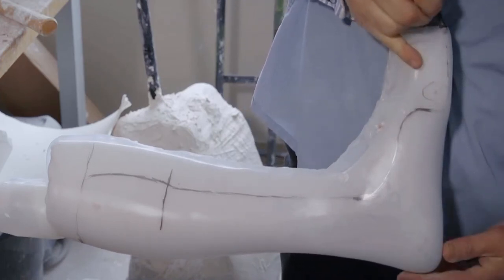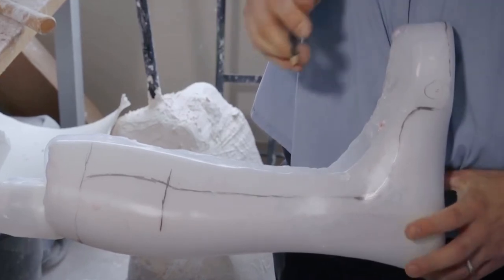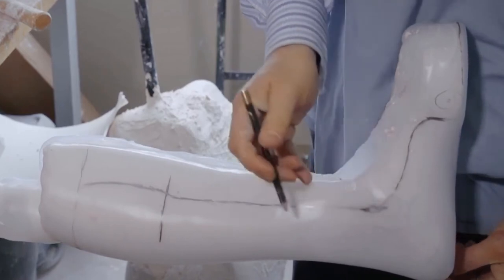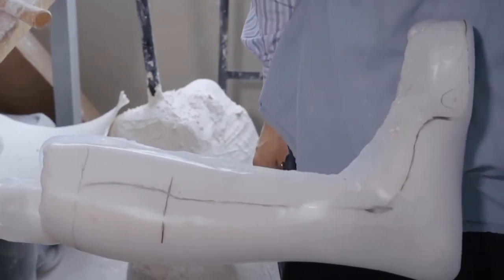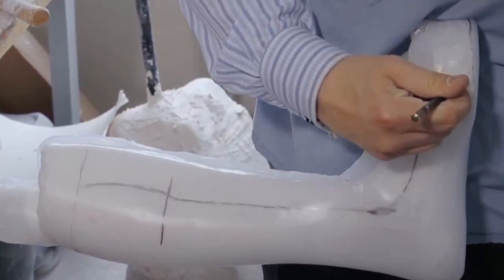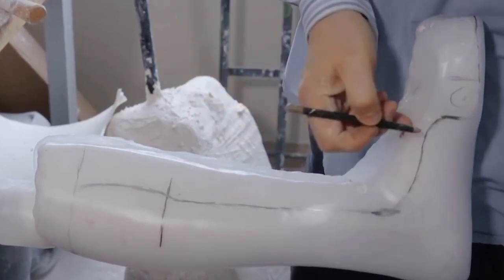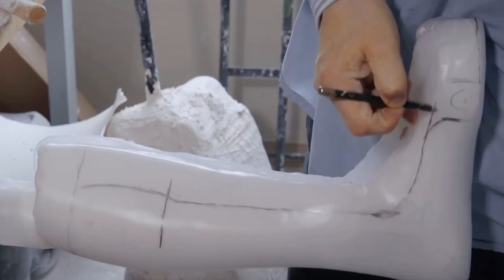We're going to make it full length at first and then review the process of trimming it back as we fit the patient. There are times when we do want to come in front of that bone, the first metatarsal phalangeal joint. So we're going to come up like this.